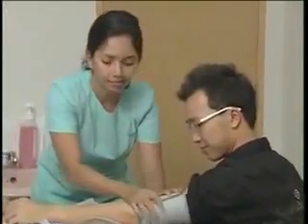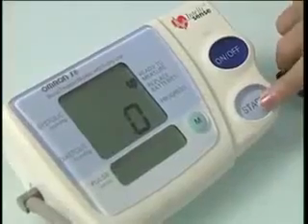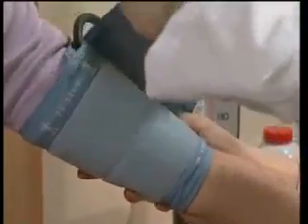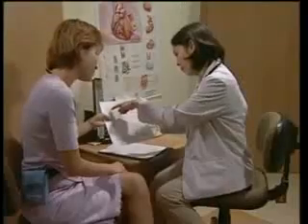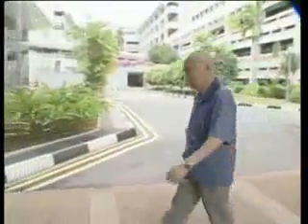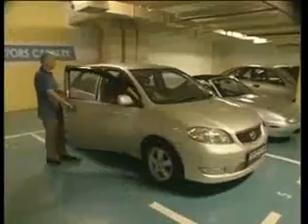When we look at a person who's young and you measure the blood pressure at the brachial artery, you actually find that the brachial pressure is very different and actually significantly higher than the central pressure. It can be as big as 30 millimeters of mercury. But when we grow older, the brachial pressure and the central pressure come closer. That also means that the vessels get stiffer.